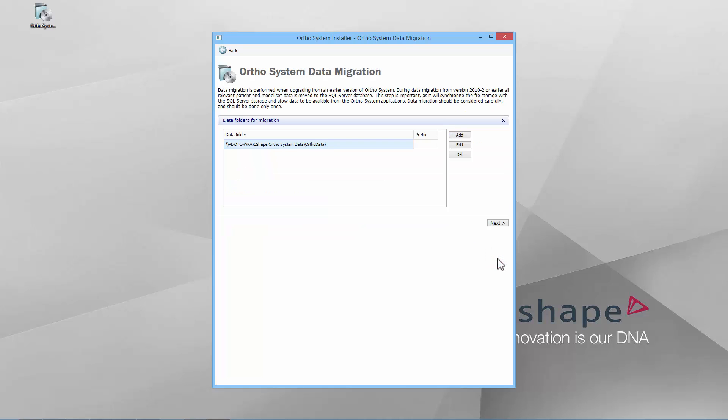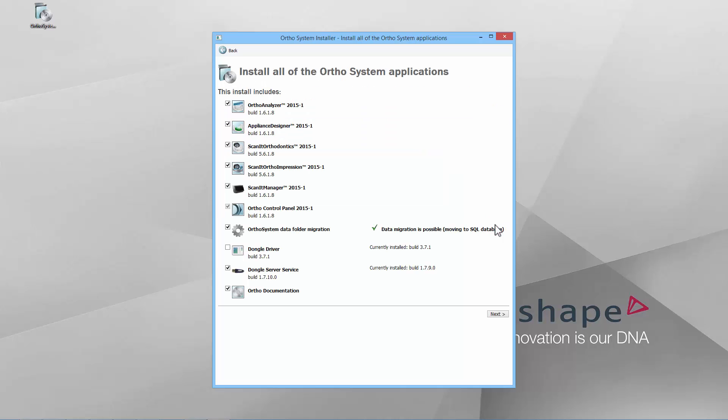In this step, OrthoData will be migrated to a new database. Click the Next button. In this window, you may choose which applications of OrthoSystem to install.